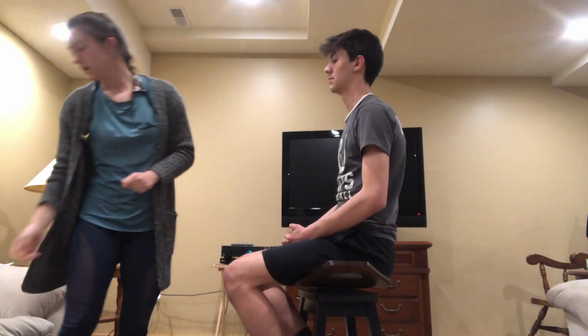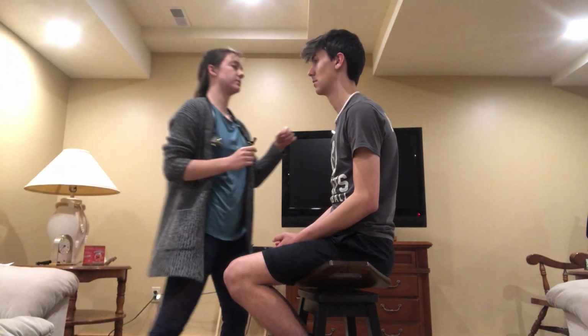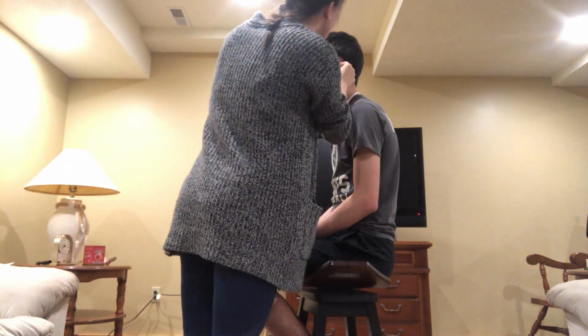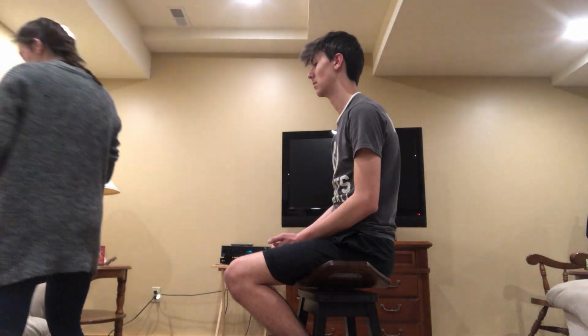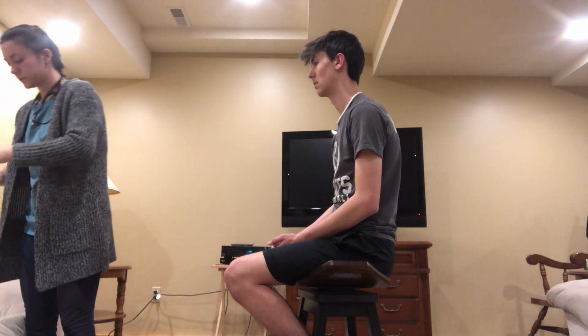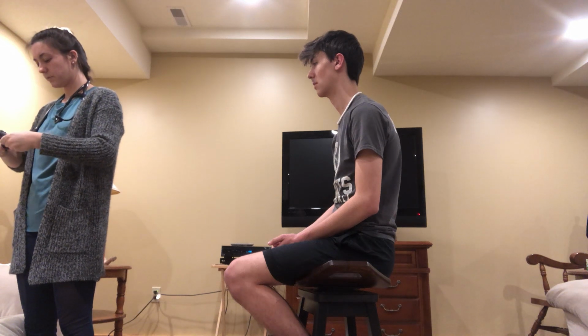Okay. Following that, I'm going to proceed with my ear exam. I'm going to first inspect my patient's external ear, the auricle and the pinna. Okay. I'm then going to use my otoscope and speculum. I'm going to position my patient's head appropriately.